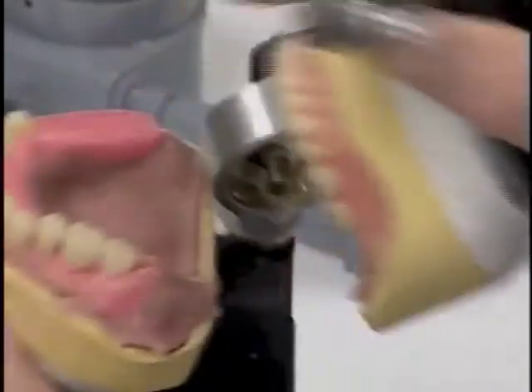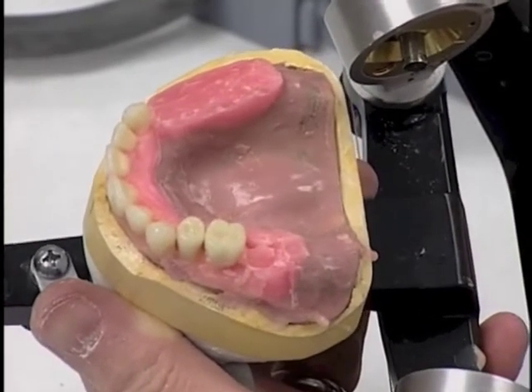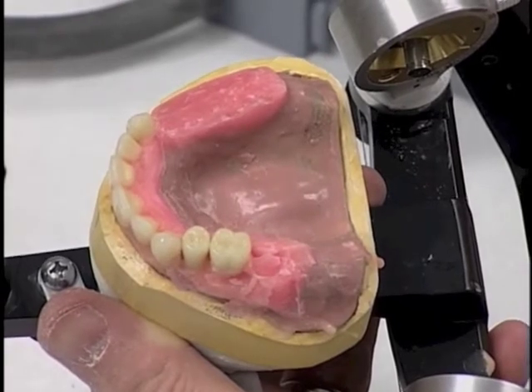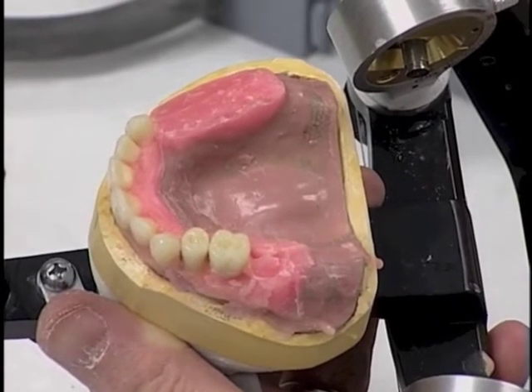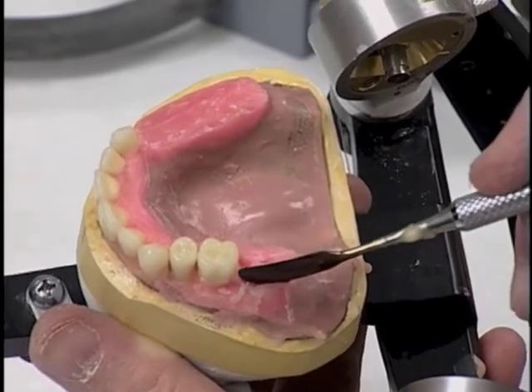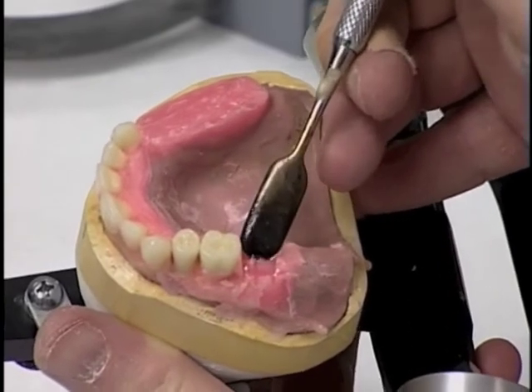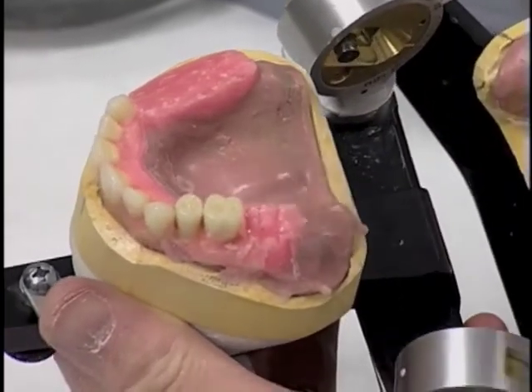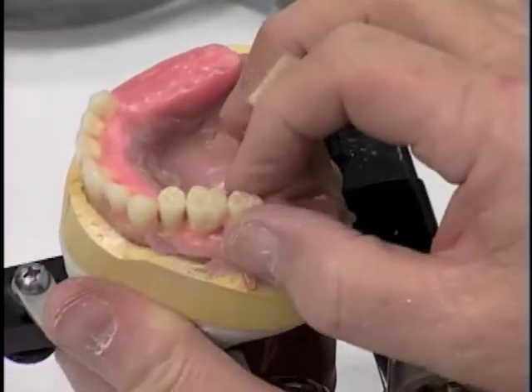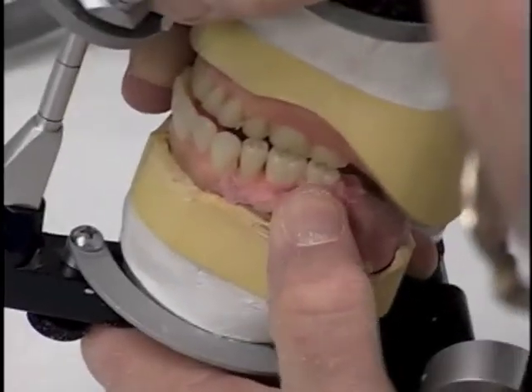It's good on the first molar. The second molar is not quite there, so I'm going to pull that wax a little more, soften it so that I can work with that tooth a little more and get it to the point to where the occlusal plane is flat and we have good contact with the mandibular molars without interference. So we get the tooth roughly in place and then close the articulator.